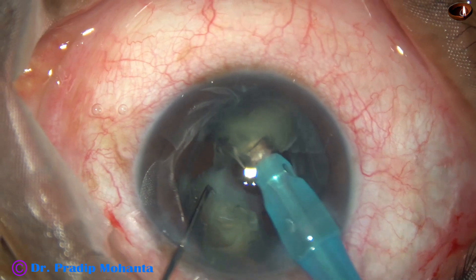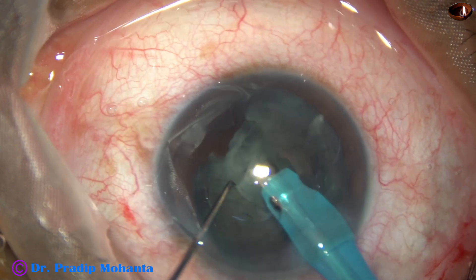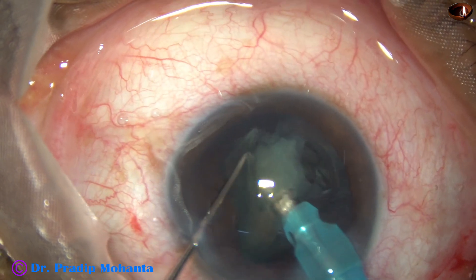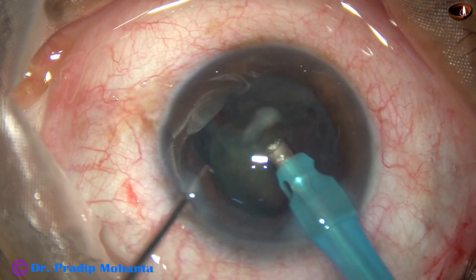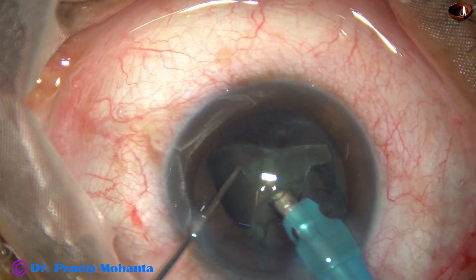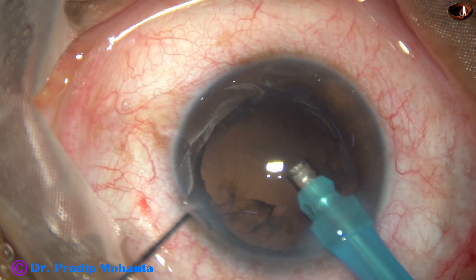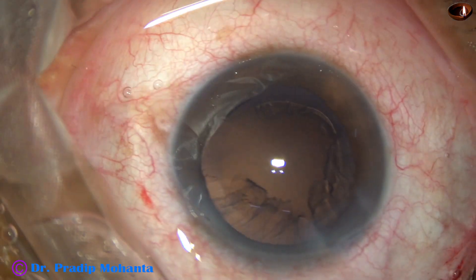This is the other hemi-nucleus. You must hold at the middle of the fragment — there must be some thick nuclear mass in front when you apply vacuum and a bit of ultrasonic energy. During removal of the epinucleus, the vacuum is reduced to about 200 and flow rate is about 25.